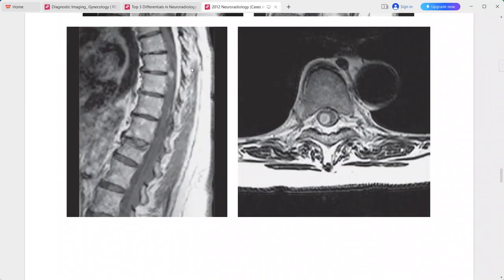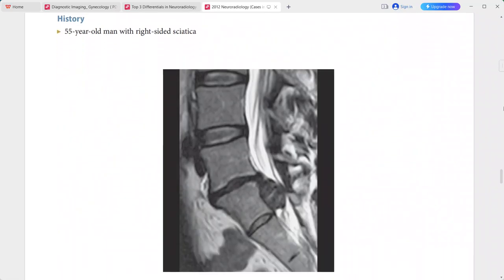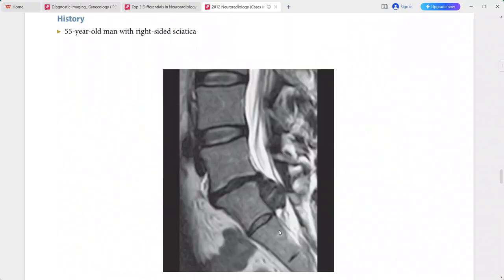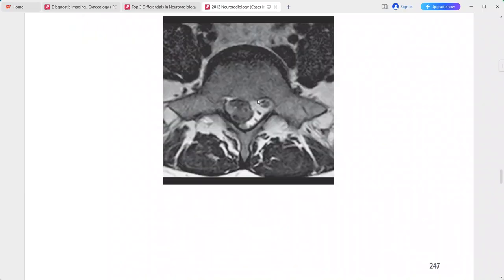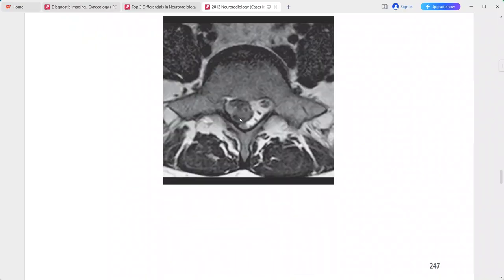Differentials also include hemangioblastoma or metastasis. Next is a 55-year-old man presenting with right-sided sciatica. On sagittal and axial T2-weighted MRI, there is a hypointense ventral epidural mass dorsal to the S1 vertebral body. On axial sequence, it is eccentric to the right side.